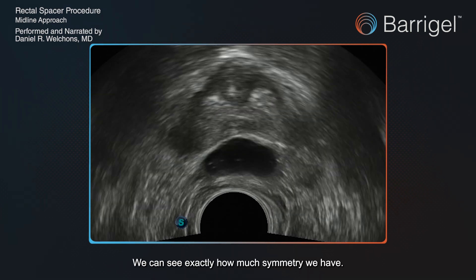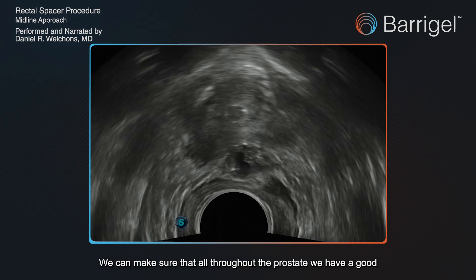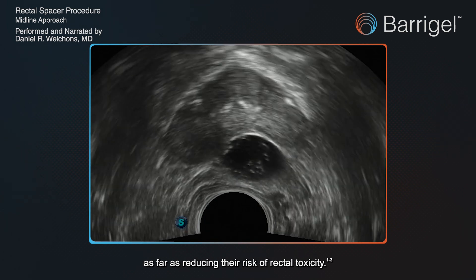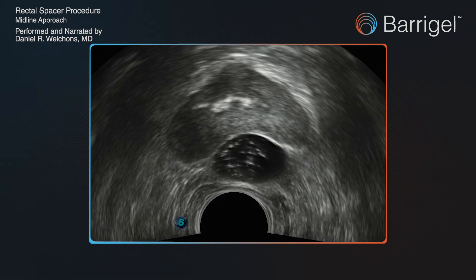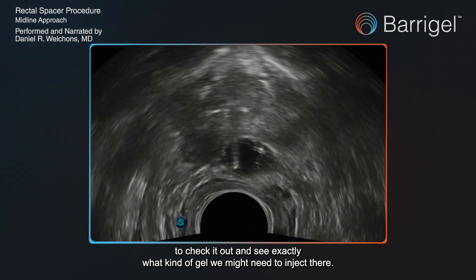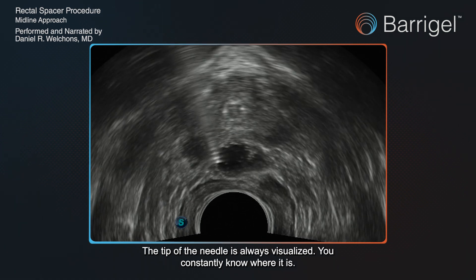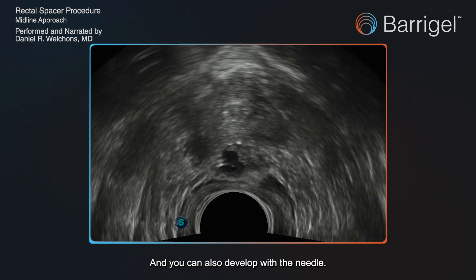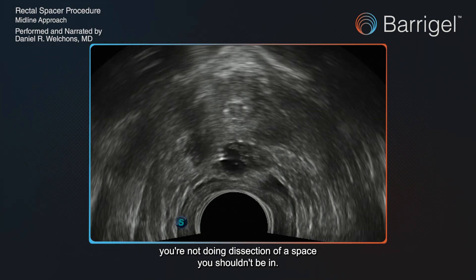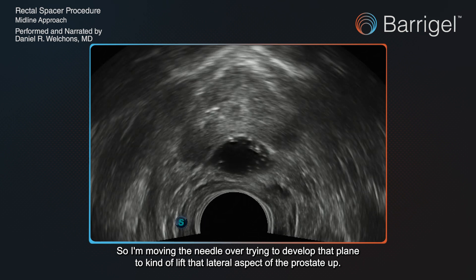Going back to the axial view, we can see exactly how much symmetry we have, how much space we're developing, and make sure that throughout the prostate we have a good space developed — one that's going to give the patient the best result in reducing their risk of rectal toxicity. Here we're going back towards the apex to check it out and see exactly what gel we might need to inject there. The tip of the needle is always visualized. You can see it so well and see the gel so well that you can be confident when you're dissecting you're not in a space you shouldn't be. I'm moving the needle over, trying to develop that plane to lift the lateral aspect of the prostate up.